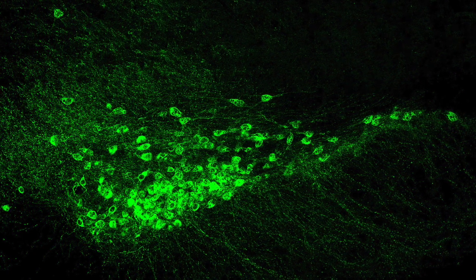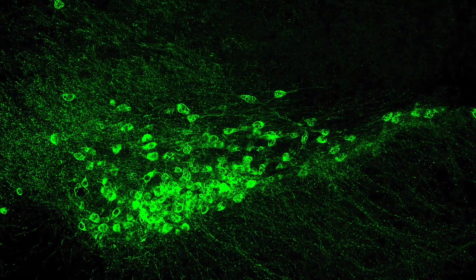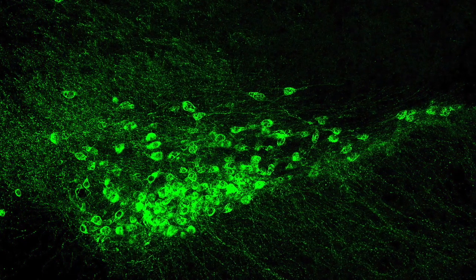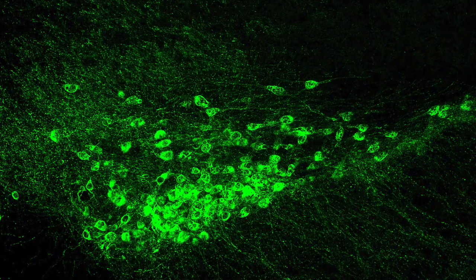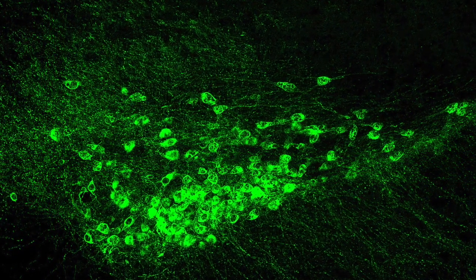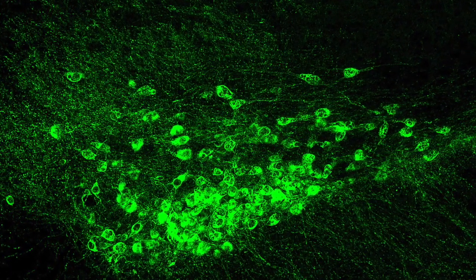For example, in this sample, immunohistochemistry and fluorescence microscopy have been used to identify dopamine neurons in the substantia nigra. There are many ways to use these tools to better understand the structure and function of the brain. So let's take a look at the specific steps involved.